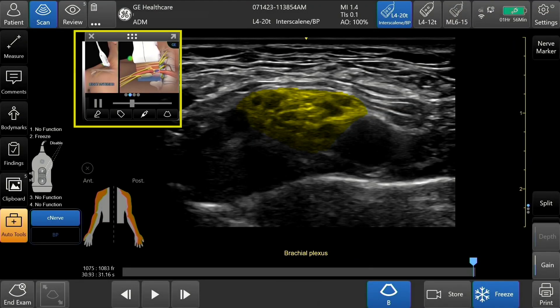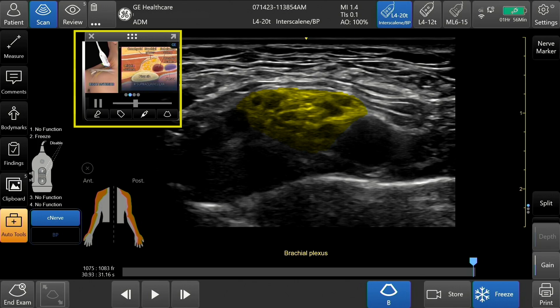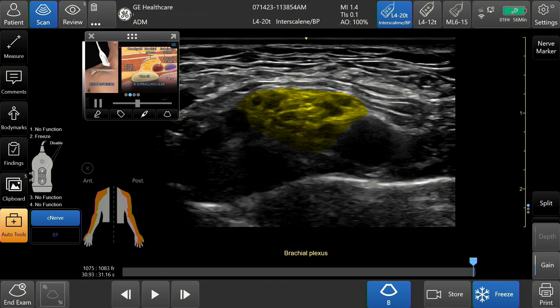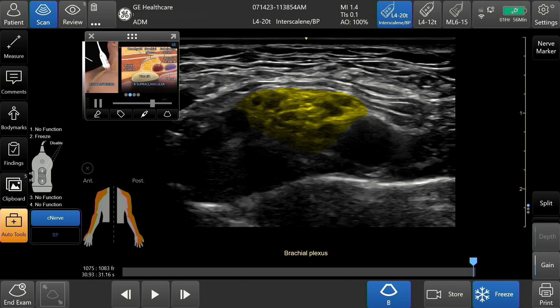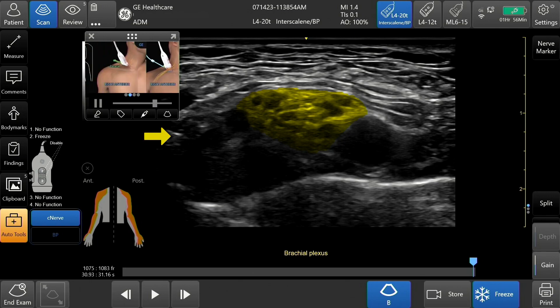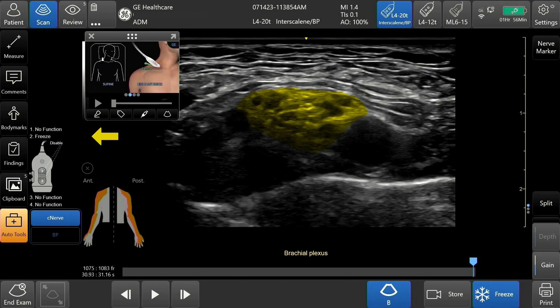The reference image can be seen in the upper left-hand corner of the image. It includes a dynamic video of probe position, anatomy, and reference image. During patient scanning, the reference image assists in acquiring the correct view and orientation.